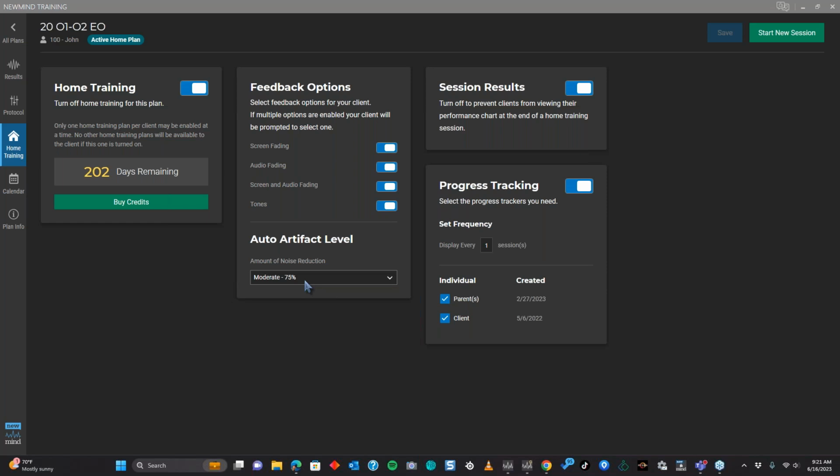Talk them through some things. Is your tongue pressed against the roof of your mouth? Are you holding any tension in your forehead or your jaw? Are you nice and relaxed? Are your feet flat on the floor? Your hands, just flat on your lap? Kind of walk them through. You could start it up, look at the signals, and explain to them what you're seeing.